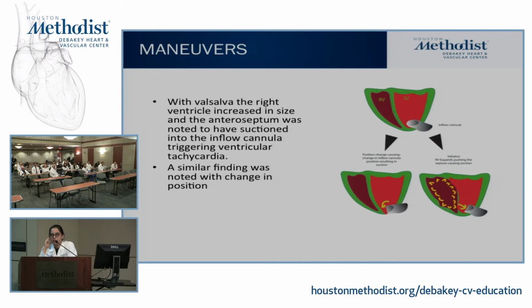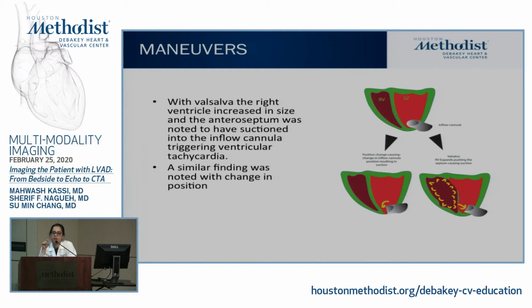Although you don't have to have the presence of all three, you can have just one. If you have the echo feature of it, that means they're having suction. And they can get symptomatic, like they'll get dizzy. It also depends on how long the suction lasts. If somebody had suction for a good 30 seconds, it will be more meaningful as compared to somebody who had suction for only 5 seconds.